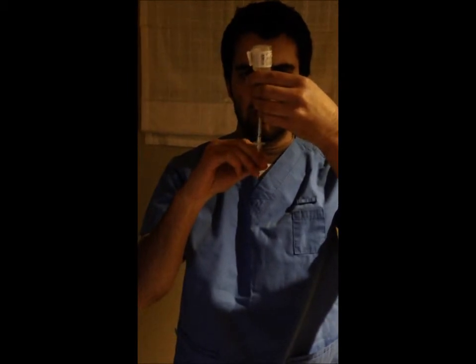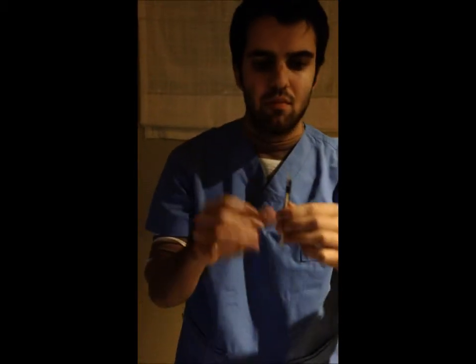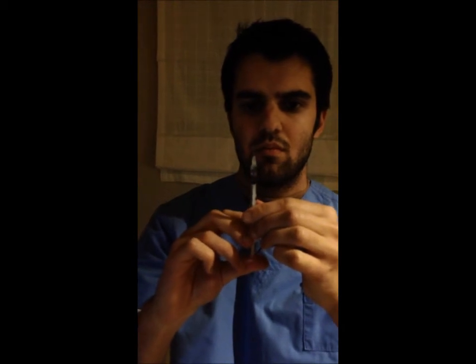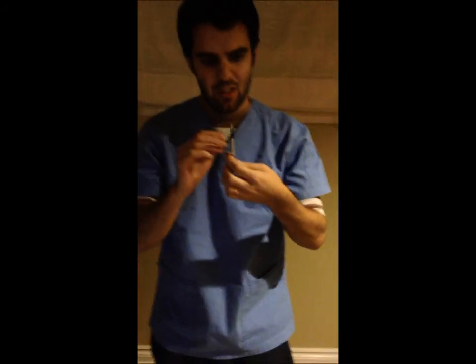Okay. Just going to get rid of the air bubble. Getting rid of the air bubble. Okay, and there's 20 units of insulin. So there we go. You can clearly see how much insulin is in my needle, and we're good.